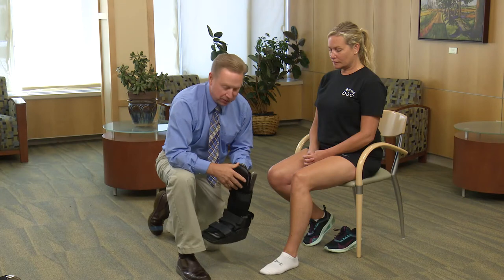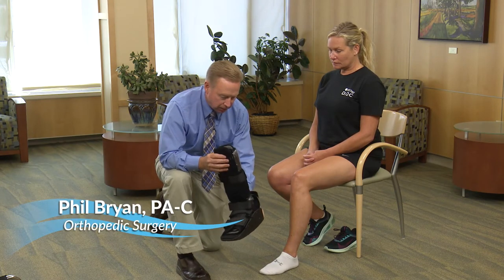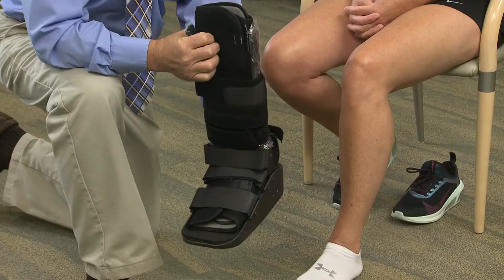Hello, I'm Phil Bryan from Orthopedic Surgery. I'm here today to discuss a cam boot and the application both from a provider standpoint and care from a patient standpoint.